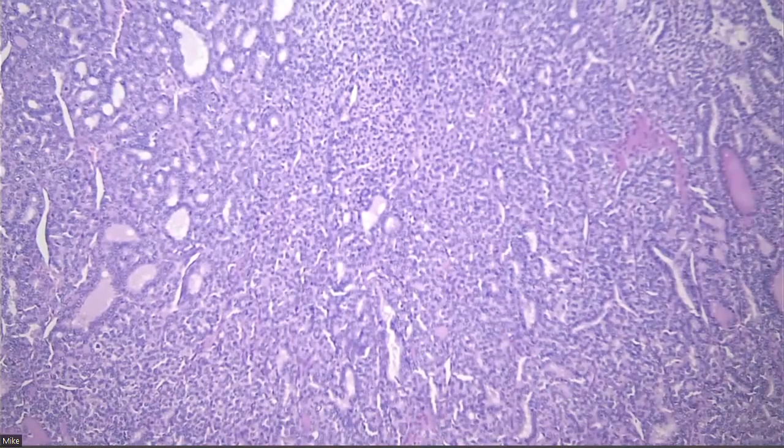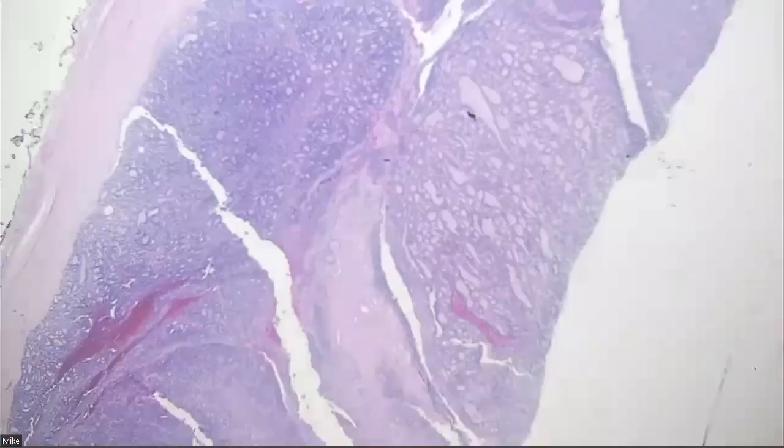However, even if you don't see solid growth, you can still be high grade. Here's nice solid growth. If you have necrosis or increased mitosis, right? So the important thing to look for is necrosis and increased mitosis. The subtle clue that you might be dealing with something higher grade certainly is if you start seeing solid or trabecular or insular growth, right?